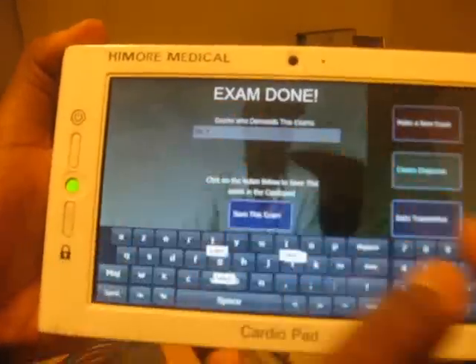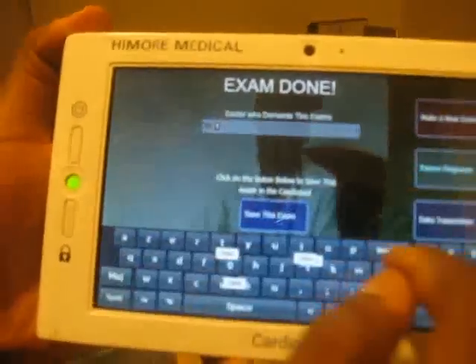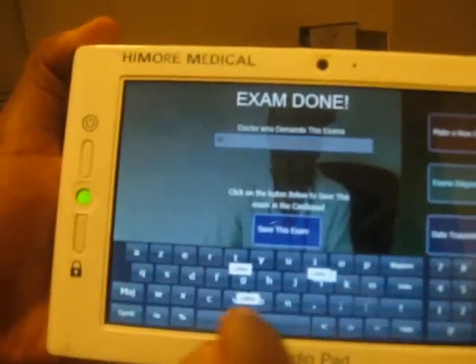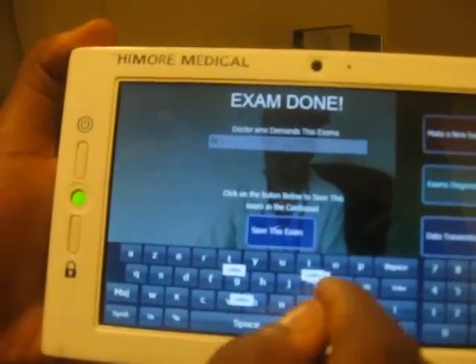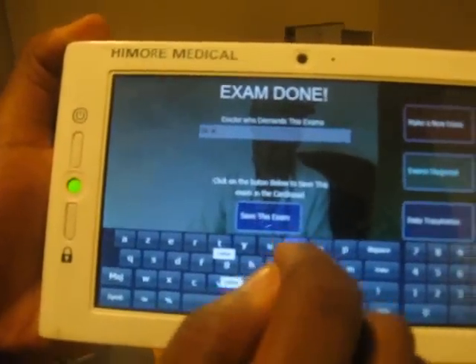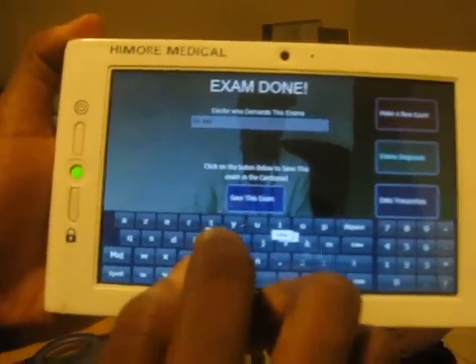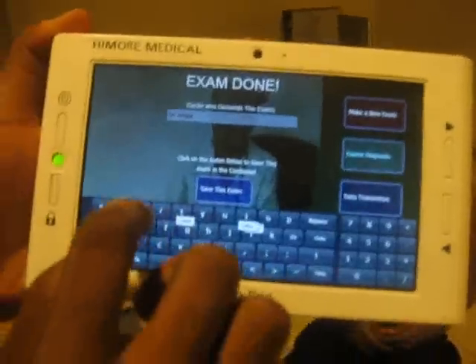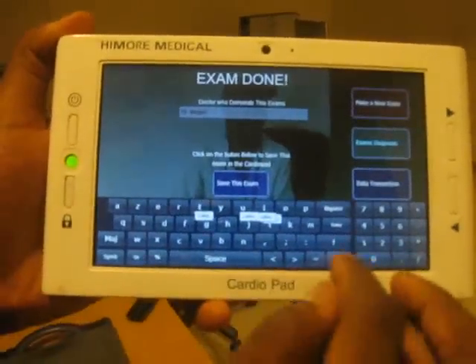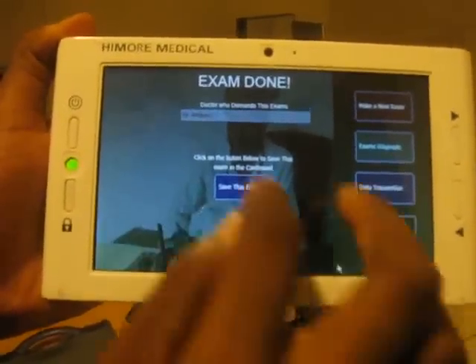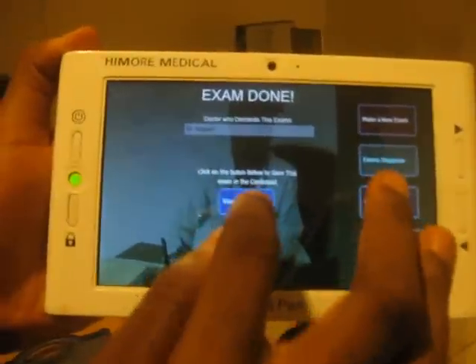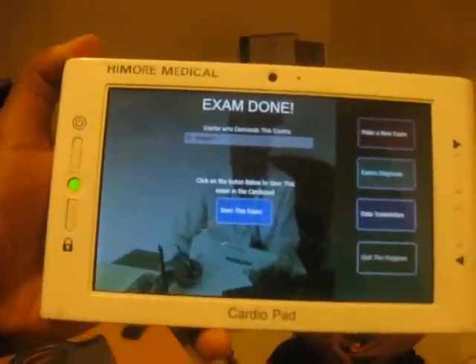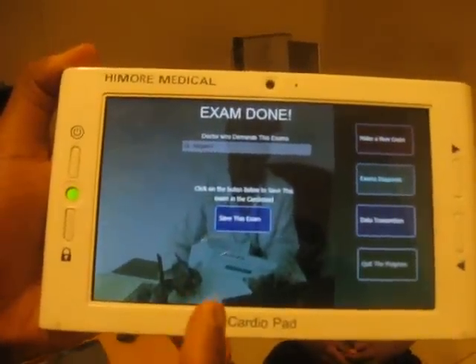In this step, the nurse will enter the name of the cardiologist who requested the examination and then save the examination data into the database of the Cardiopad.